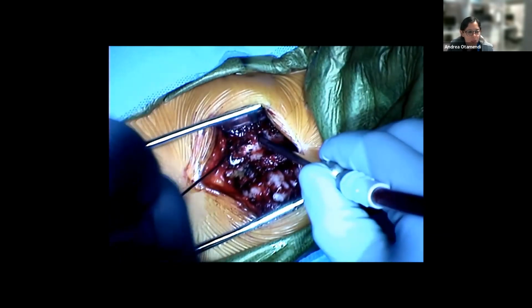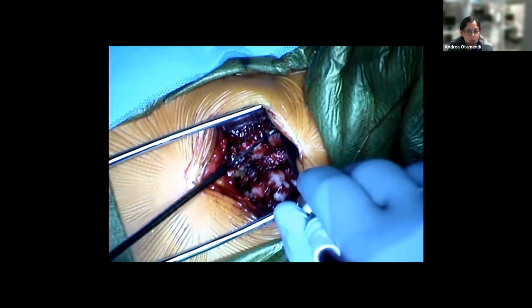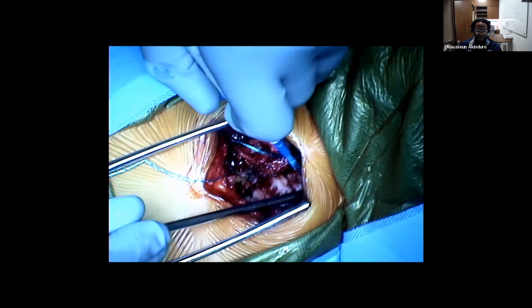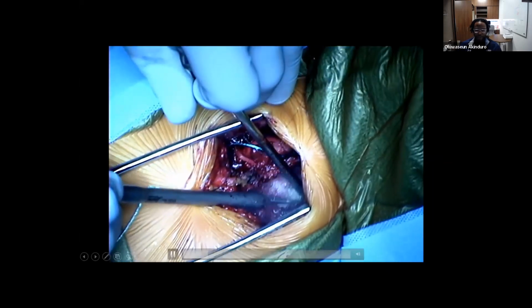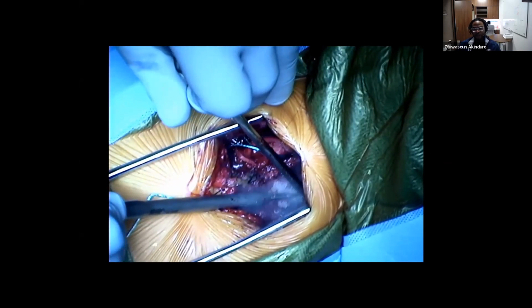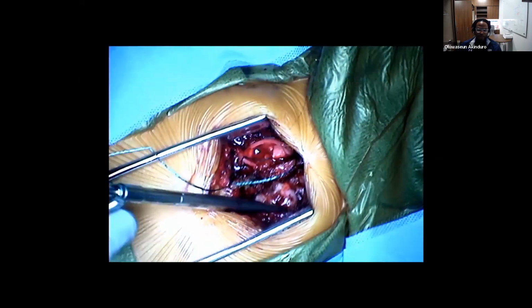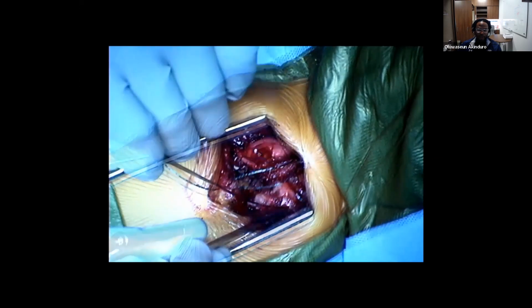I could add some comments here. Yeah, we didn't do the laminectomy yet. Here, we just placed the screws. You typically want to place your screws before doing the lami, so you're not placing screws over an exposed spinal cord. But what I was doing earlier was drilling out.